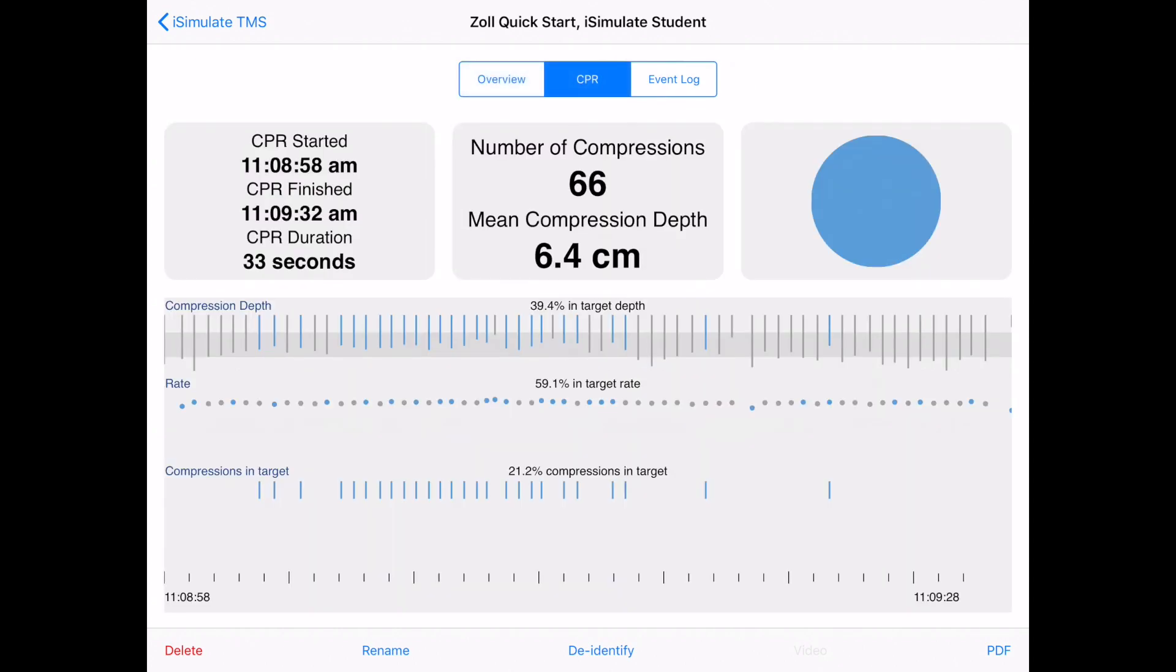The next screen is the CPR screen. This shows me the compressions that I've done. And a nice summary diagram is shown with some graphical representation here.